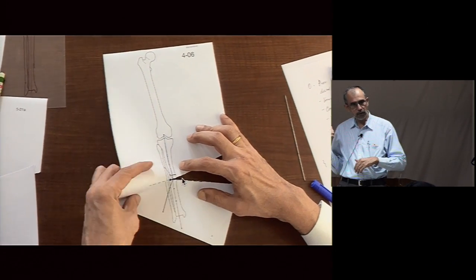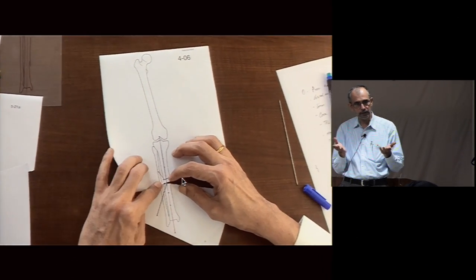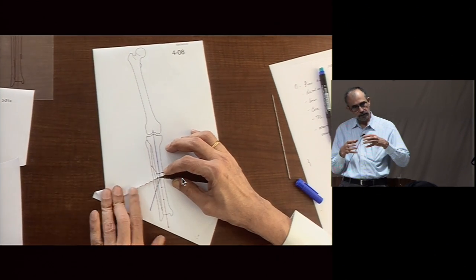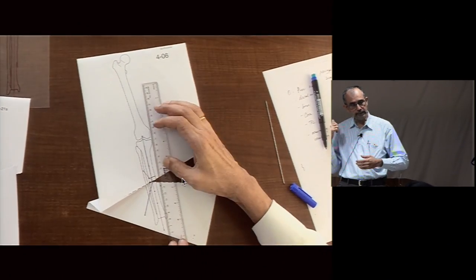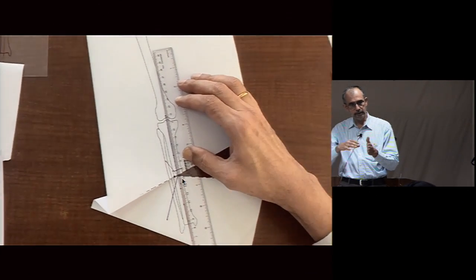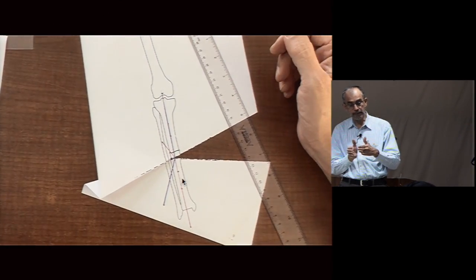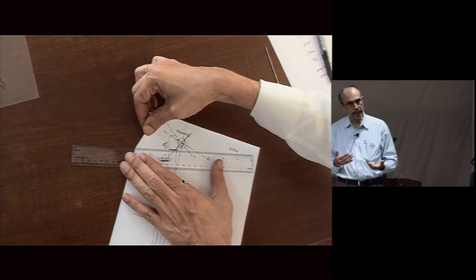So now once you know that this is the issue, because the fracture is like an osteotomy, all you have to do is correct that translation. And this is something you can see on the C-arm, that yes, I can see that there is a golf club, and especially if it is not parallel, then you can move it. This also happens with lock plates.